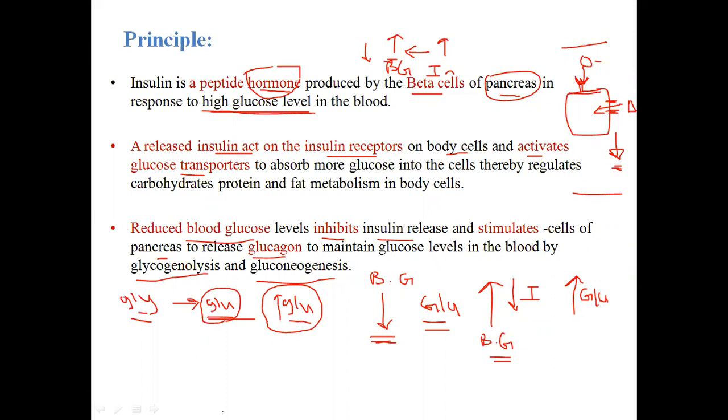Yes, is that clear to all? Roll number 3. Yes, sir. Okay. Roll number 20. Yes, roll number 20, are you with me? Roll number 21. Yes, sir. Okay. So, roll number 20, yes, sir. Okay, fine. So this is the principle of the experiment.